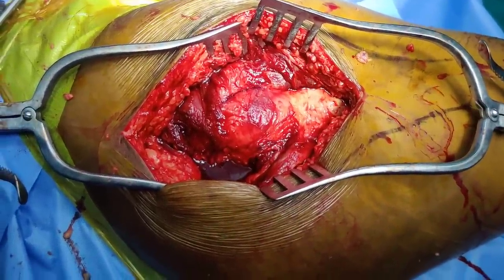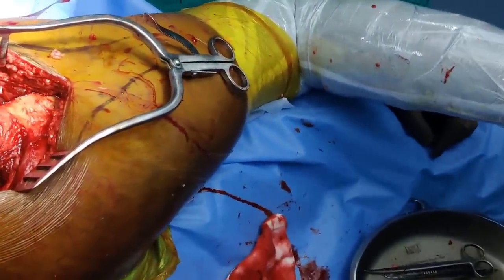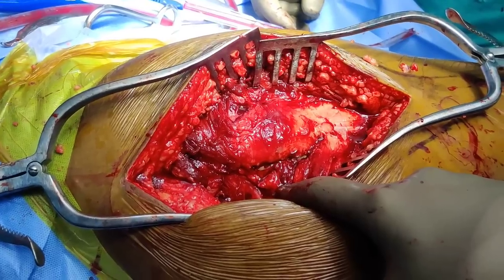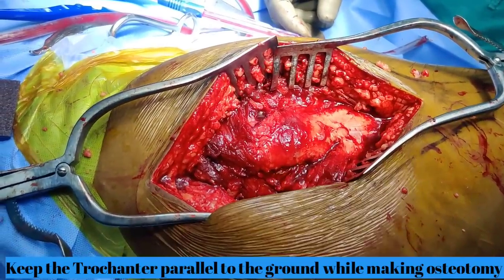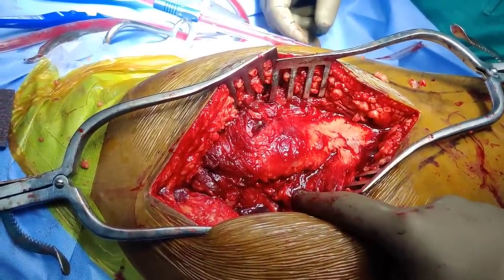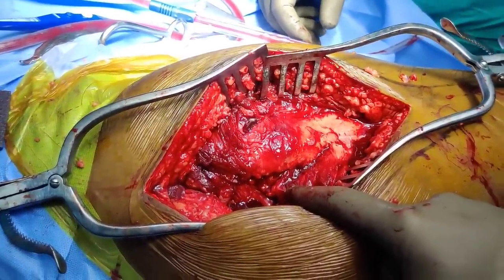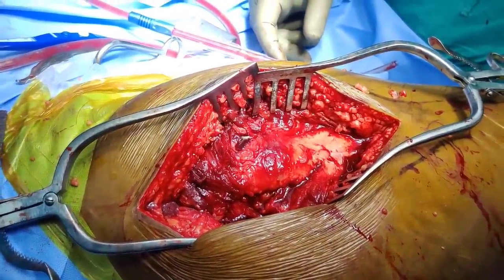While we get the leg internally rotated, as you do in a hip replacement, we will try to keep the GT parallel to the floor and then we should be ready for our osteotomy. I have marked the osteotomy site. You can make the osteotomy either straightforward or you can make a step cut osteotomy which some people prefer, as they believe it increases the rate of union, but in my experience even a straightforward osteotomy does the job. The next step will be to do the osteotomy.